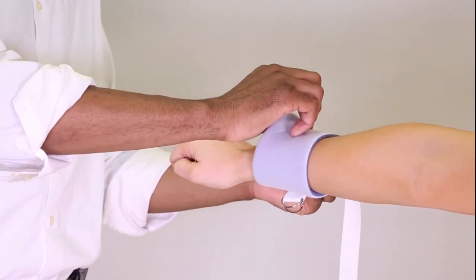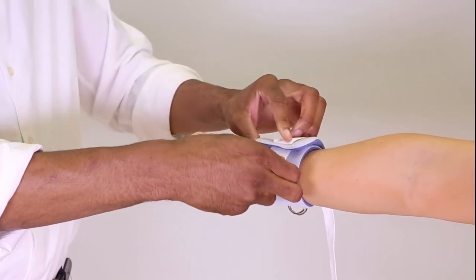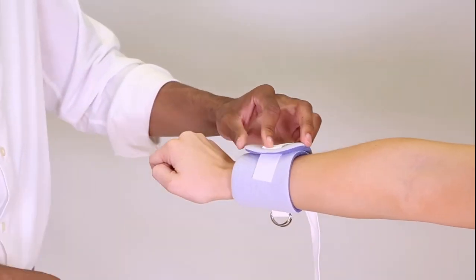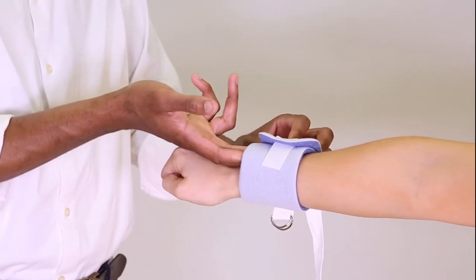Apply the cuff to the wrist, making sure the cuff closure is on the outside of the device. Secure the hook tab to the cuff. Make sure two fingers fit between the device and the patient.